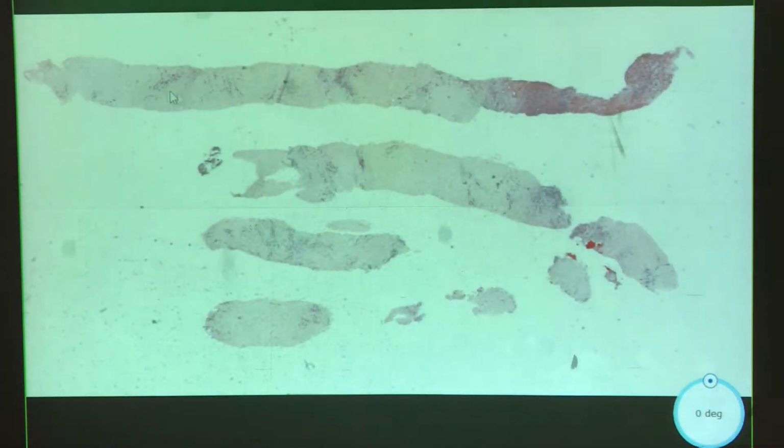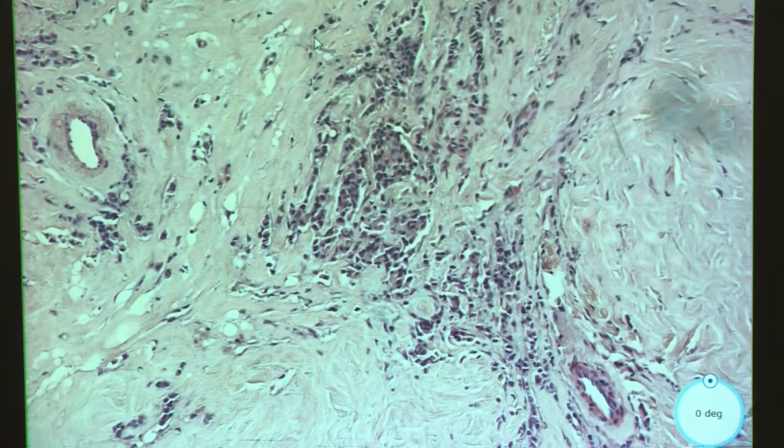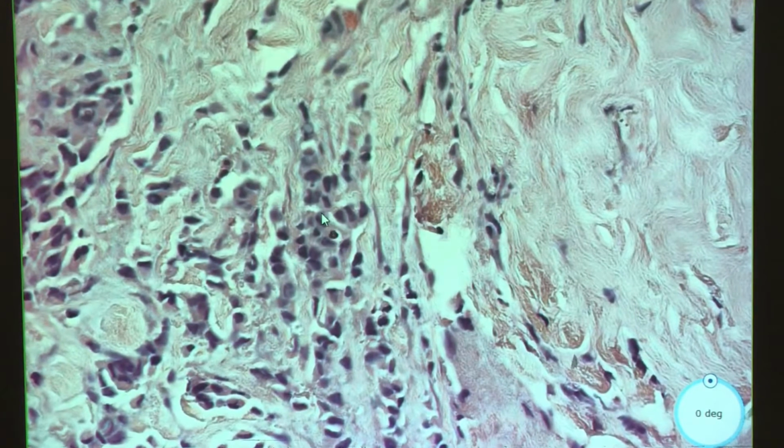Okay, next case. So kind of the same thing. We see there's a lot of fibrous tissue, maybe some fibroadenomatous change, and this is probably our lesion, but let's just check out what this looks like first. And we start seeing stuff almost immediately, but let's go to the meat of the issue. You guys start seeing that now, how we still have the single filing. These cells are maybe a little more eosinophilic. Hey, look, there's our mucin that's hanging out. There's some more.